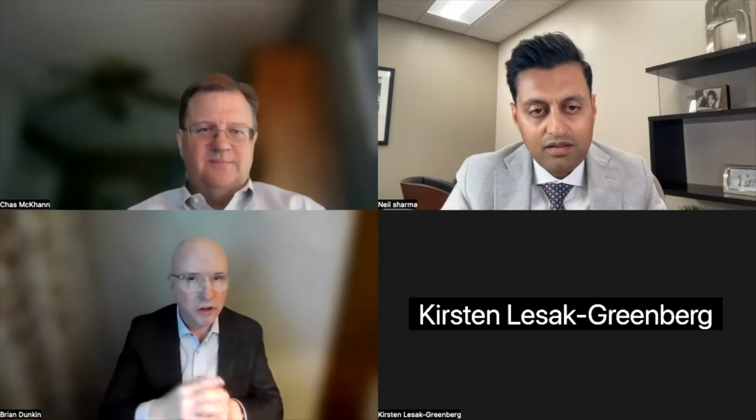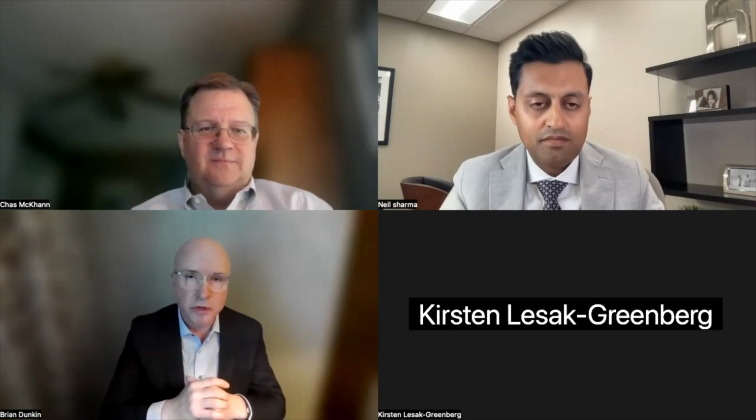And Neil, I think of it a little bit broadly. Therapeutic endoscopists are doing things in the hepatobiliary and pancreas space under ultrasound guidance and with needle acquisitions and other technologies that really do replace what we did surgically not so long ago. The third space of endoscopy as well, with POEM and POP and Z-POEM and some of the more advanced mucosal resections with advanced EMR and ESD, that's all an example of endoluminal surgery.